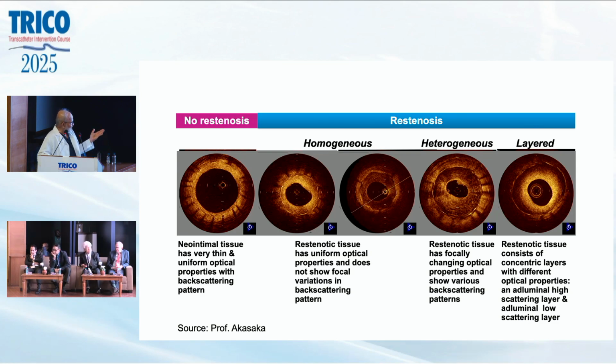Rajiv, in Samir Pancholi's case, what he has shown, we were discussing homogeneous, heterogeneous, and layered. And only this area has shown some promising result with drug-eluting balloon. Am I correct, Professor? Yes, only homogeneous, and also the high scatter. High scatter. Yeah. Second from left. Yeah.